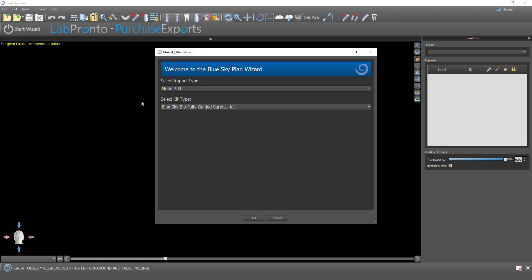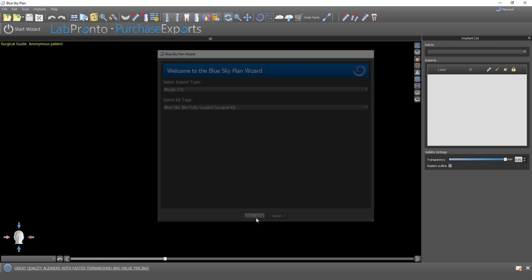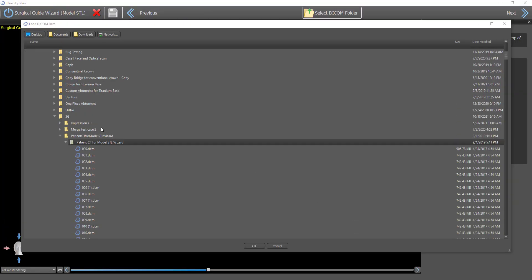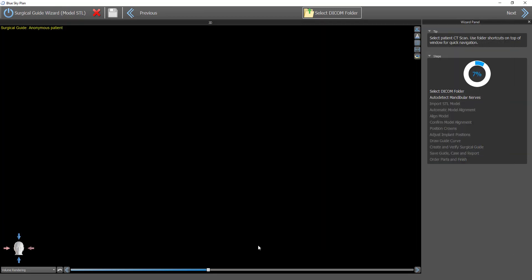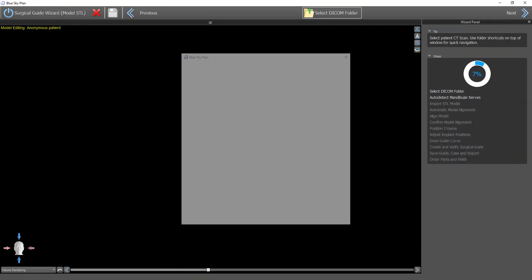What I'm doing now is importing, selecting the import prototype model STL, and I'm going to demonstrate this using the Blue Sky Bio fully guided surgical kit. We have our shortcuts on the top. I'm going to select the relevant icon, load it into the software.